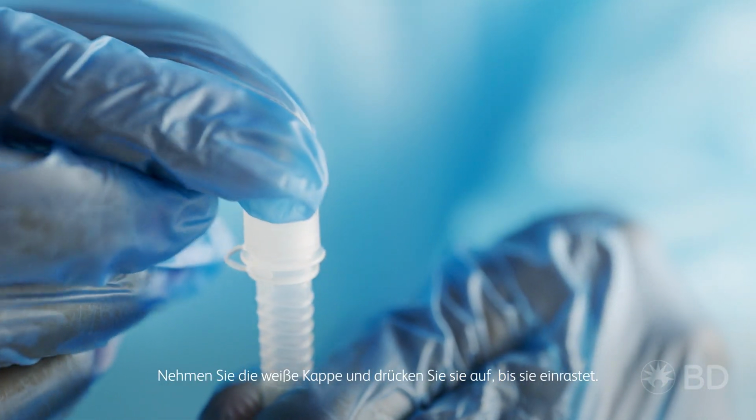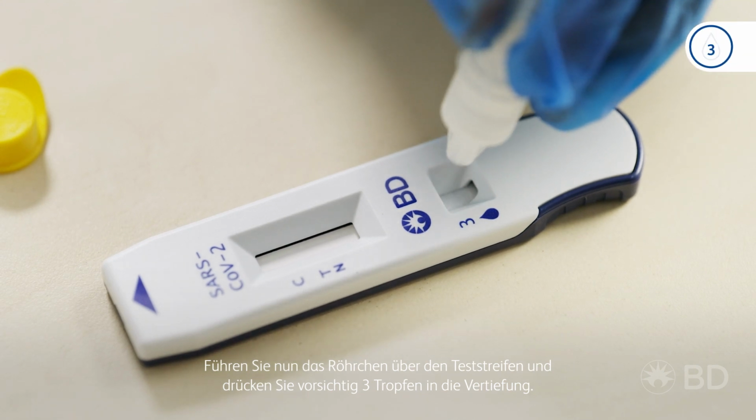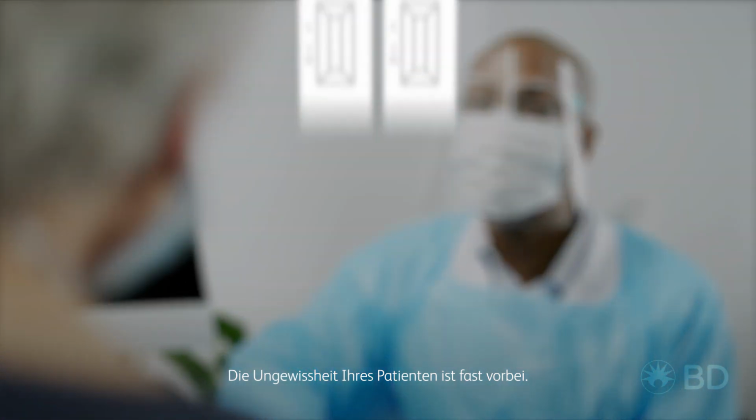Take the white cap and push it on until it clicks into place. Now, hover the tube over the test strip and carefully squeeze 3 drops into the well. Once that's done, set a timer for 15 minutes. Your patient's uncertainty is nearly over.